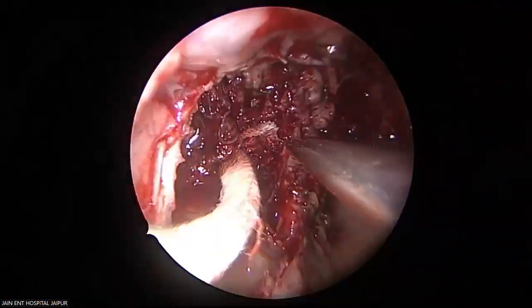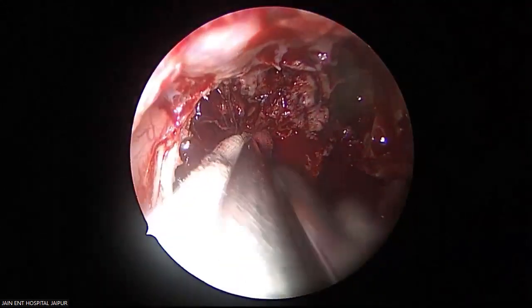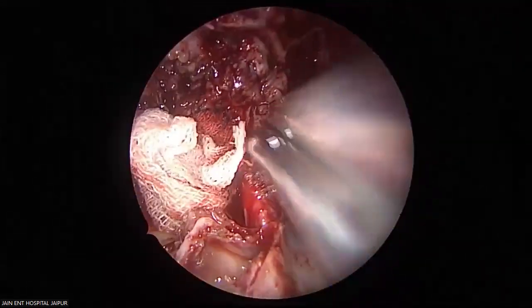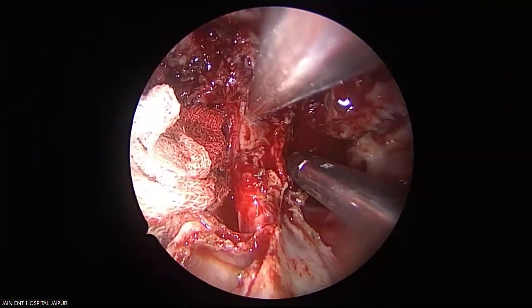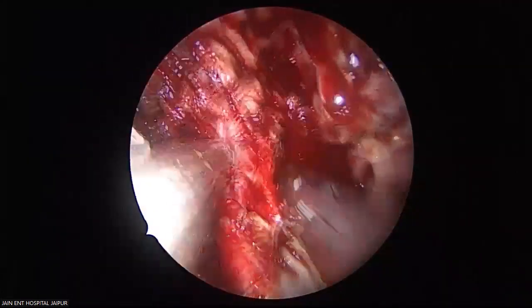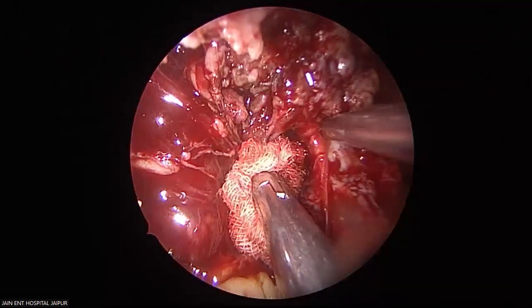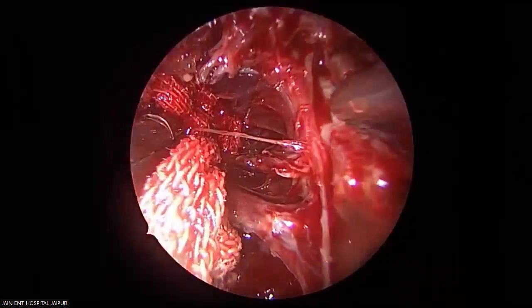Hardly anything. You just pack, I will leave a cervical control. We have already clipped the vessel distally, further distally after removal of the tumor. See, this is the infratemporal fossa. This is your lateral pterygoid plate. See everyone? This is pterygoid plate. This is lateral pterygoid plate. This is pterygoid fossa containing the tumor. Now lateral to this is all musculature, where the tumor was occupying and we have pulled out completely. Only muscles, nothing else.